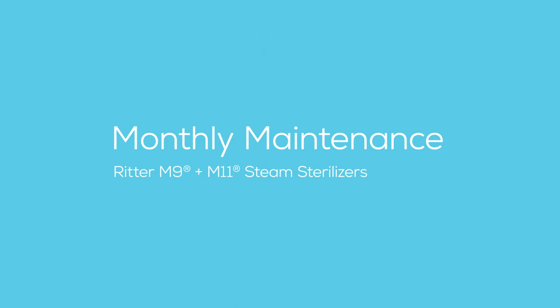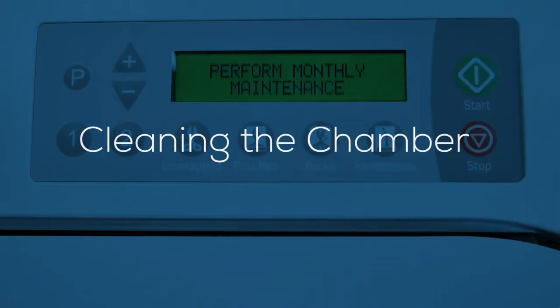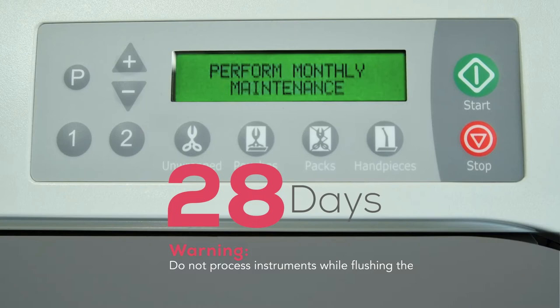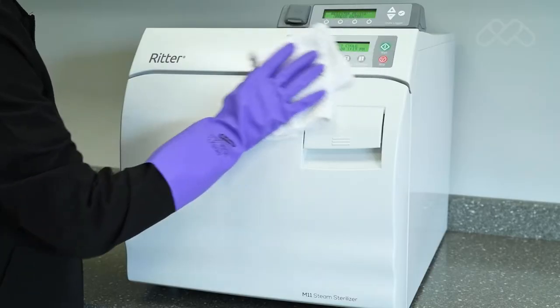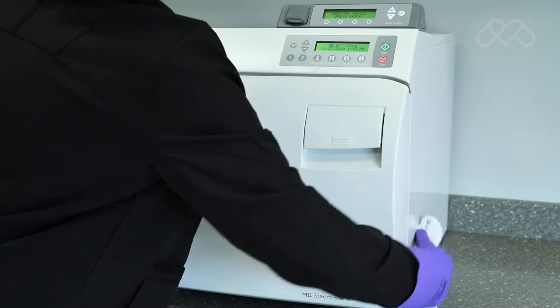This video provides an overview of the monthly maintenance for Ritter M9 and M11 steam sterilizers. Always refer to the appropriate technical documentation for the complete list of instructions, safety alerts, and sequence of procedures before conducting any service or maintenance operations. Every 28 days, the sterilizer will briefly automatically display a 'perform monthly maintenance' message after a completed sterilization cycle. This requires a more thorough cleaning of the unit and involves multiple steps.